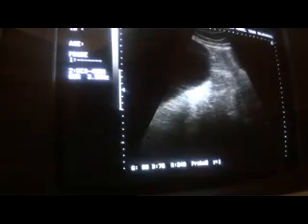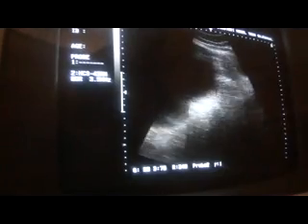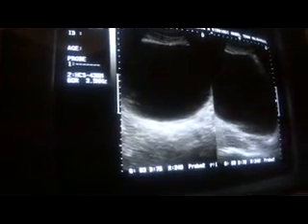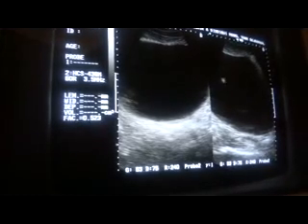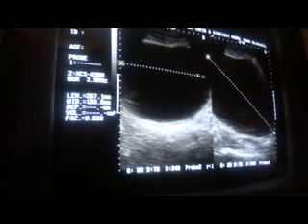So this is a huge ovarian cyst that is extending from the right adnexa in the midline up to the umbilical region with an approximate volume of, it is too large to get it in one single view in total. However, its average volume is, this is the longitudinal section.